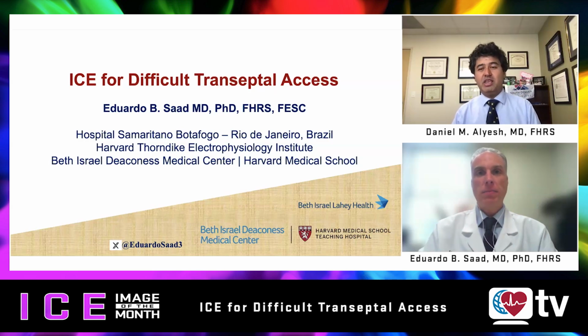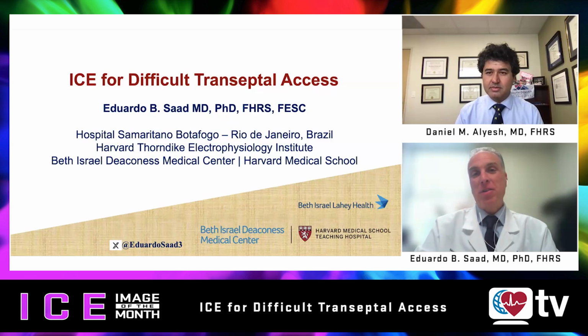Today, our topic is intracardiac echo as applied to transseptal access, specifically focusing on troubleshooting difficult transseptal accesses. For that reason, I'm joined today by Dr. Eduardo Saad. He has two affiliations, one with Beth Israel Hospital in Boston, and also Hospital Samaritano in Rio de Janeiro, Brazil. Welcome. Thank you, Dan. Really a pleasure to join you today.